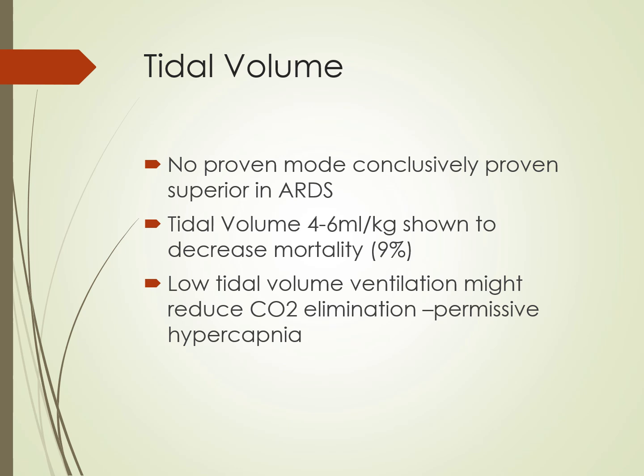With a lower tidal volume, you can expect that you're not going to blow off as much CO2. So what happens is your CO2 is going to rise. So this is what they call permissive hypercapnia. Permissive hypercapnia is an acceptable thing, especially with a patient with ARDS, because you don't want to over-distend the lung and you want to use low tidal volumes and high PEEP.